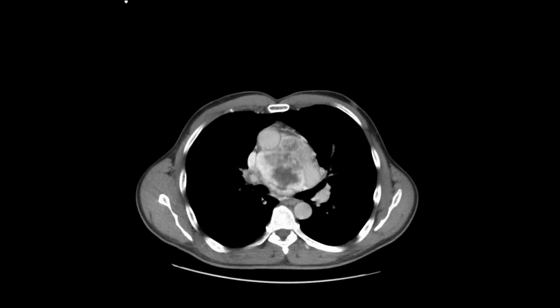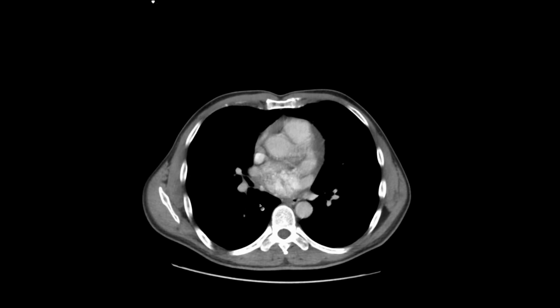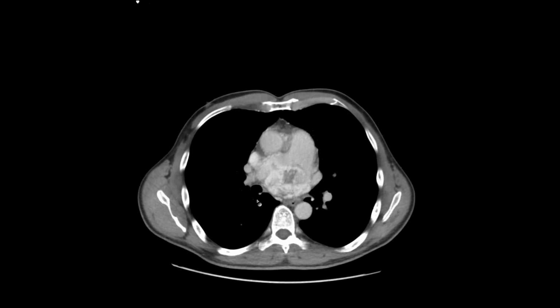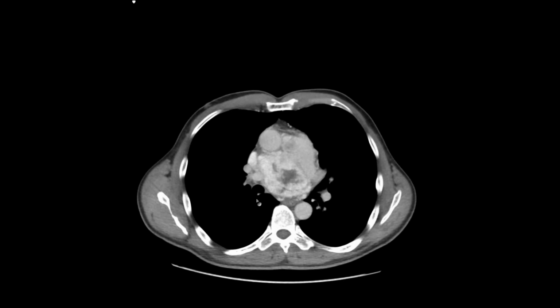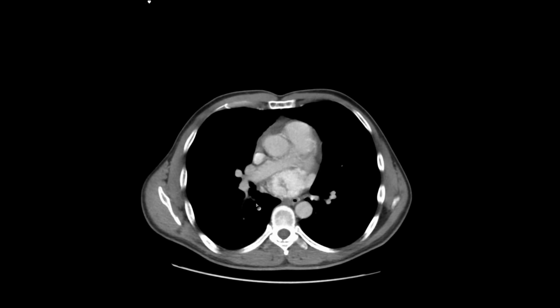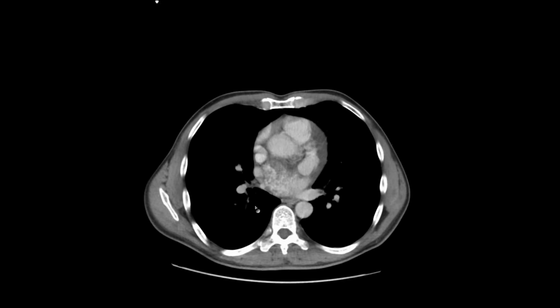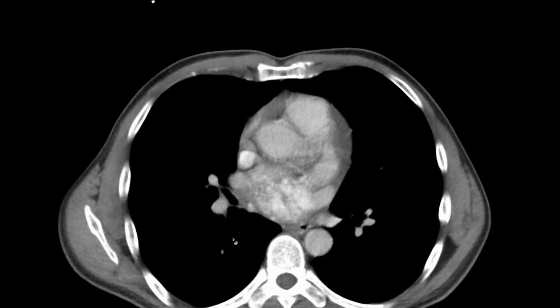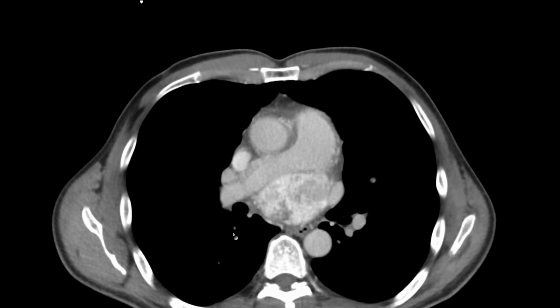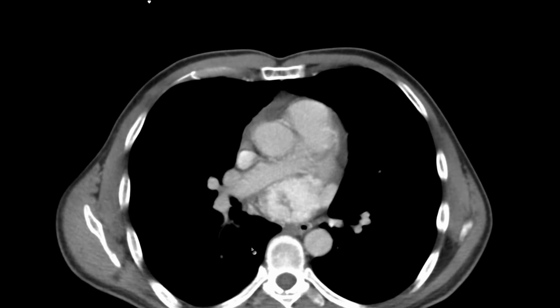Another thing, when you were showing the original one, can you scroll down slowly? Right, see that vessel running along the posterior margin of the mediastinum on the right above right there. Follow that out. It looks like it's coming into the pulmonary vein, and I almost got the sense that was draining into the tumor. Oh, that I think is just an anatomic variation of a pulmonary vein on its way to the... But coursing in the mediastinum. See, there's two vessels there. If you go up slowly, there is one that goes posterior, one goes into the lung. But the one, see that vessel coursing along the posterior there? Follow that into the tumor. It looks like it drains into the pulmonary vein. Or it goes in front of it, I couldn't tell right away when you were scrolling, or just went somewhere else, but it looks like it drops into the left atrium.